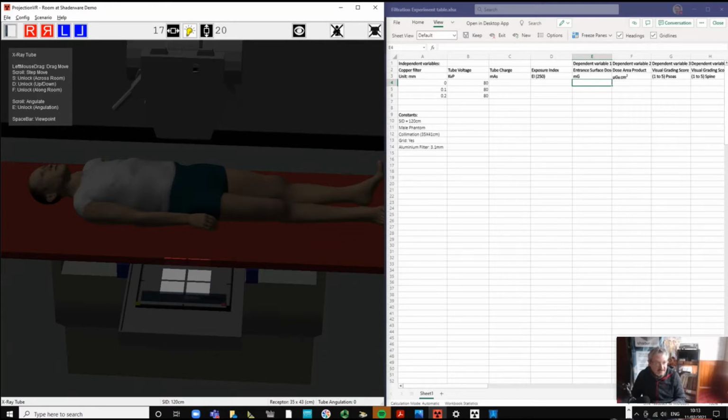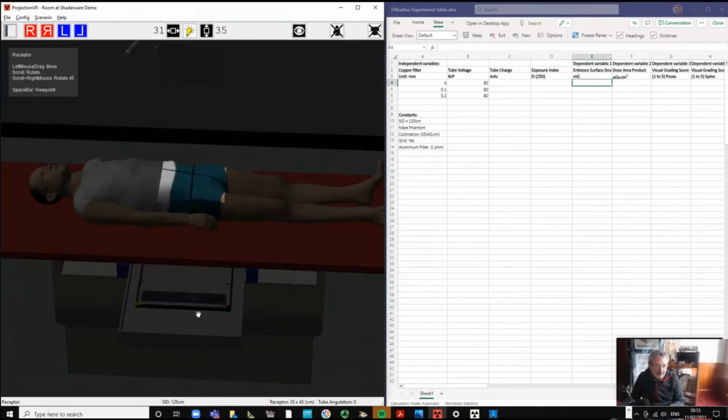I'm going to open the collimation to 35 and across to 40. 41 is slightly in from 43, isn't it? So that'll do, something like that. You happy with that? Yeah.